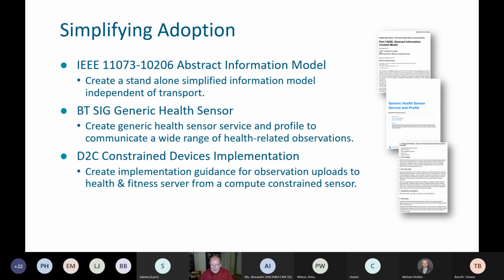In parallel with that, a lot of people say, by the time I collect the devices, I have to have a certain gateway and it gets complicated. I have to pair them. And there's a lot of times I don't really have the luxury of having a gateway. So we want the sensors to communicate directly to the cloud.